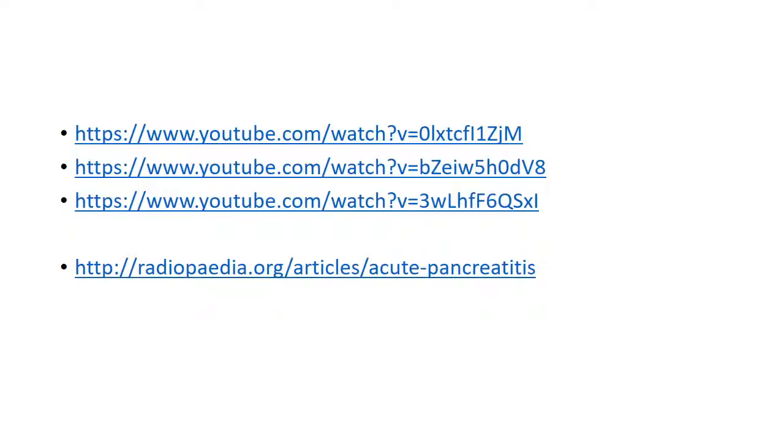So here's some references if you want to look at some walkthroughs of the CT abdomen and pelvis as well. And hopefully this has given you some idea of orientation and what to look for when you're going through some of the board questions for CT on the abdomen and pelvis.